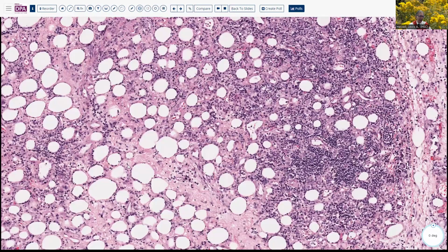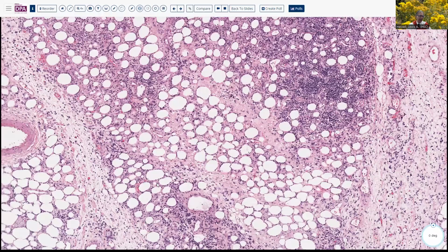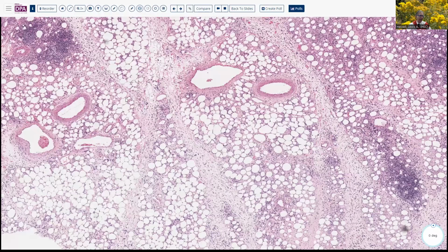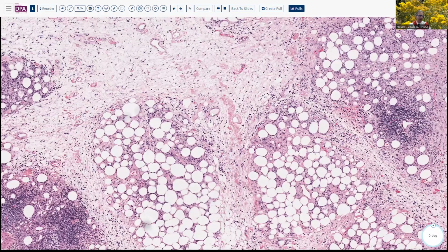And then we get a loose fibrous or myxoid tissue in between the fat adipocytes, creating an increased density to the tissue, a little bit more firm, fibrous character to it. So there's a degree of what might be termed sclerosis. You begin to see maybe a little bit of wavy collagenous fibers in a few areas in this lesion.